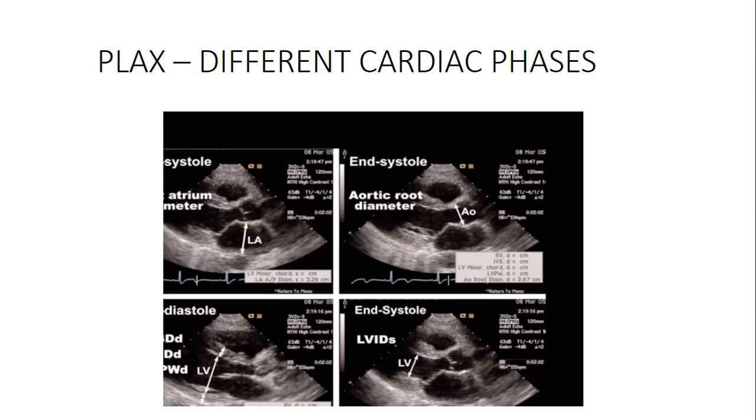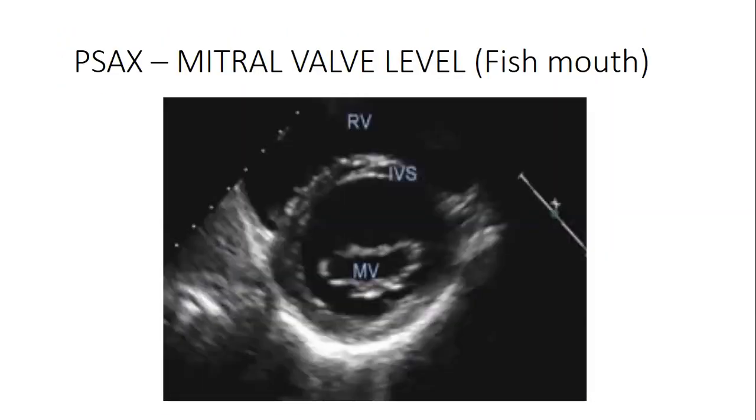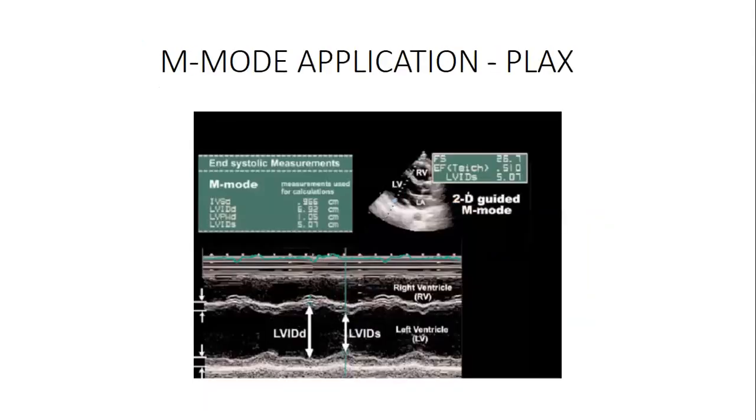I've seen a lot of people confuse this. When you say hypertrophy, they also relate it to the left ventricle dilating. Let me use this one. Are you able to see this one? Yes.